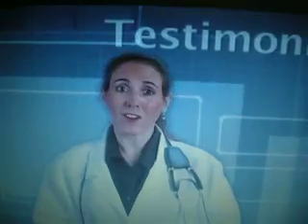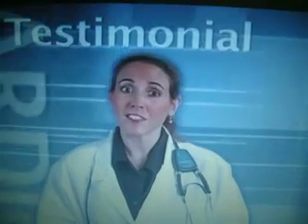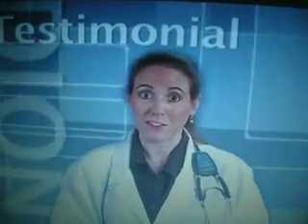So far, we've heard from 2 teaching physicians about the value that CardioSim brings to the classroom and patient teaching environment. Let's listen to a third testimonial from another CardioSim user.